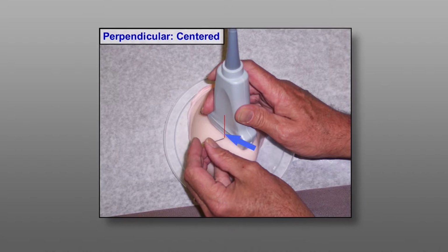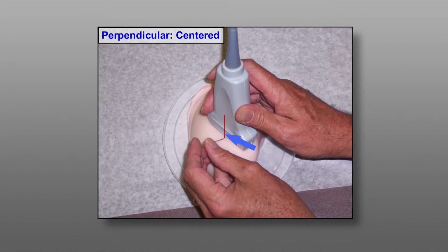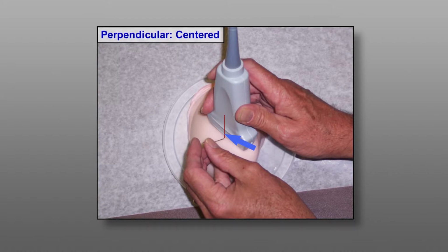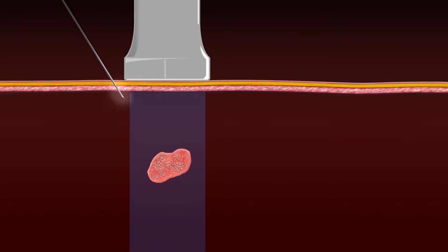Note that most probes have an indication of the center point on the long side, which is helpful for optimal placement of the needle. Make sure to allow at least 1 centimeter distance between the edge of the probe and the needle entry to allow space to change angle as needed in order to reach the target. Place local anesthesia accordingly before starting sampling.